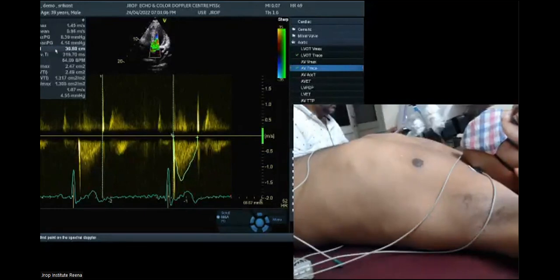I just said this about a normal 2D echo. It's like disease, it's okay. I got your point. But in a normal healthy patient, whenever we do the 2D echo and we interpret the M mode EF, how do you say that this person is normal or abnormal?